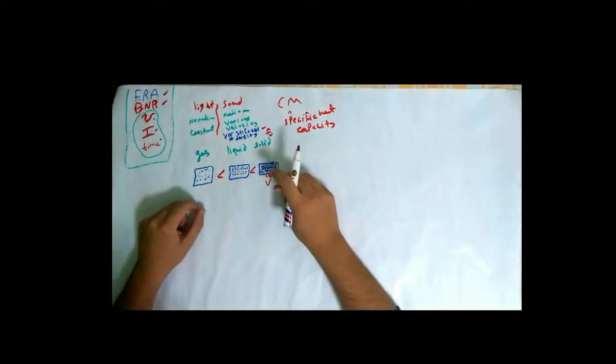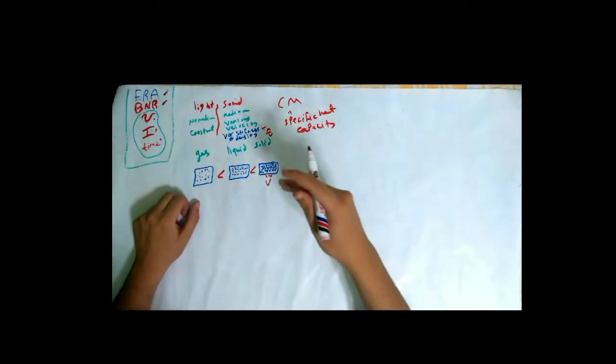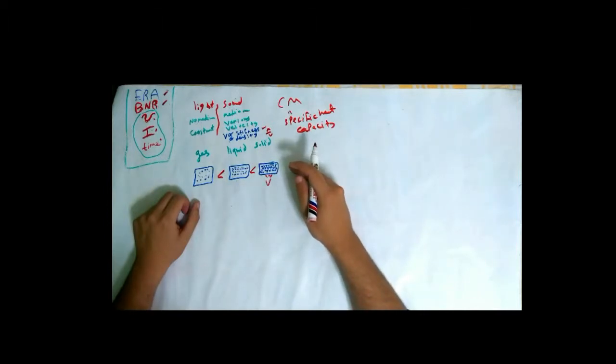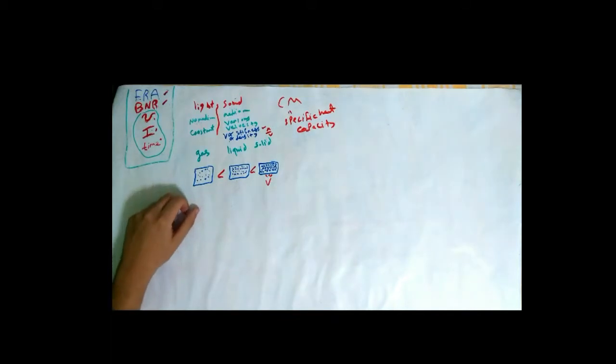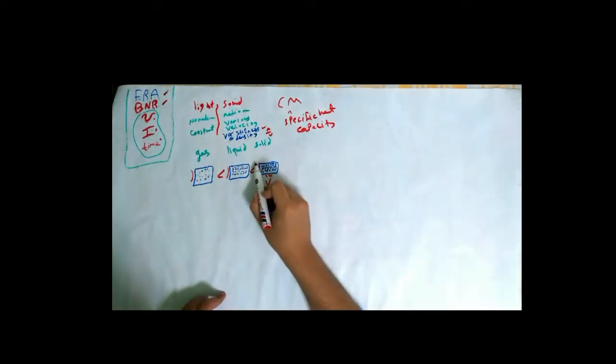So the point from this is to understand that different materials have different specific heat capacities. So if I want to increase the temperature of muscle by ultrasound, the parameters will be different than if I'm increasing the temperature of skin by 1 Celsius, because each material has its own specific heat capacity. So now let's say that we have a sound wave propagating through this square.